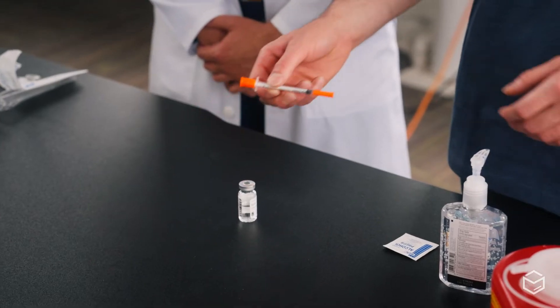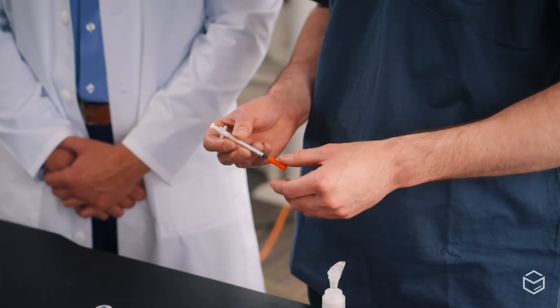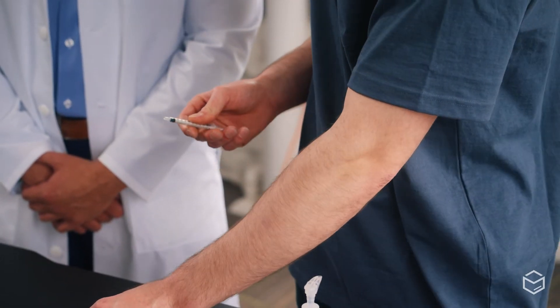Next, he'll take the syringe and draw up the prescribed dose. In this case, we'll be doing 0.25 cc's, which on the syringe will also be labeled as 25 units.